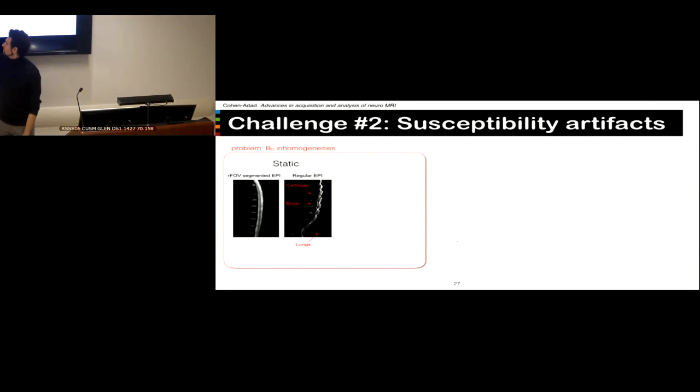It's particularly problematic in the spinal cord region because there are different structures with different susceptibility profiles, and that creates a local magnetic gradient, and that is bad for EPI because when we do imaging, we assume that on the 3 Tesla scanner we have 3 Tesla everywhere, but because of those different profiles, we have 2 point something at a particular location and 3 point epsilon at another location. So we don't have 3 Tesla everywhere, and that results in those distortions.